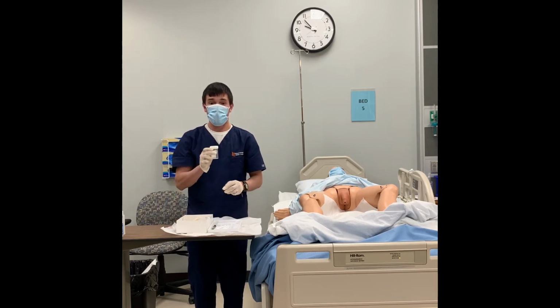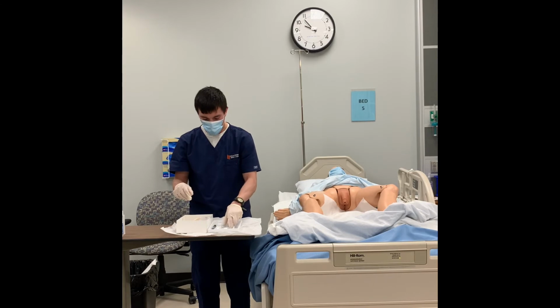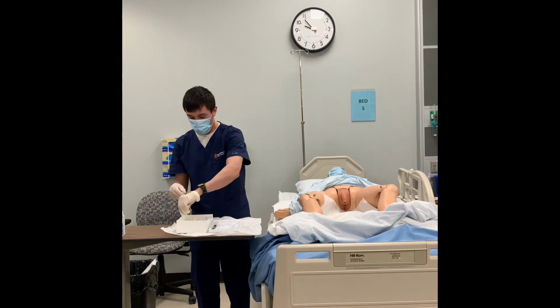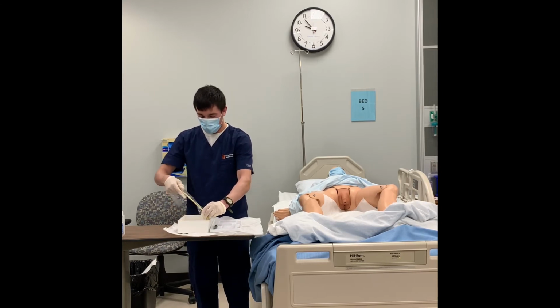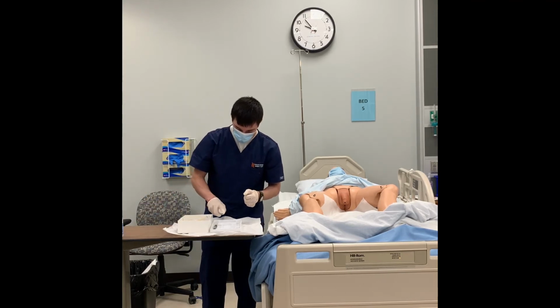So I'm not going to use my sample. We're not collecting a urine sample, so tossing that to the side, or pitching it, and then from there, I am going to move everything into one box so I can take everything over to the patient. So we are going to set those in there, and then I am going to take this off first. I'm going to take this off second. I'm going to go ahead and put my lubricant in here, so I have that ready.